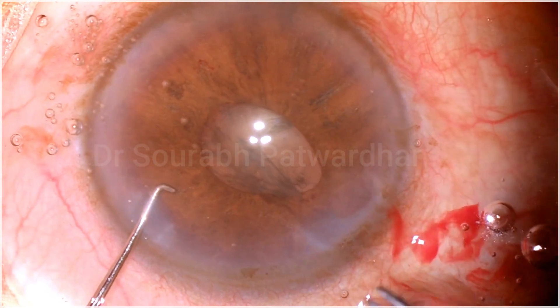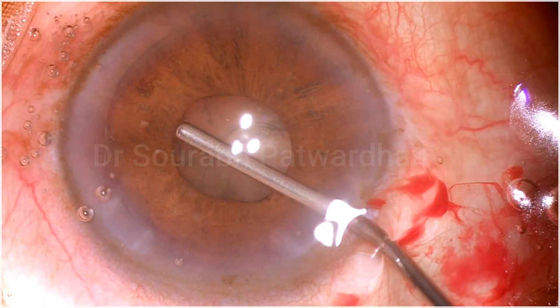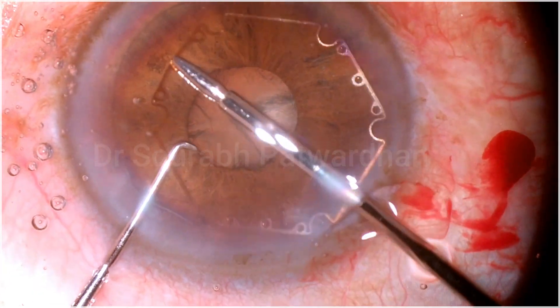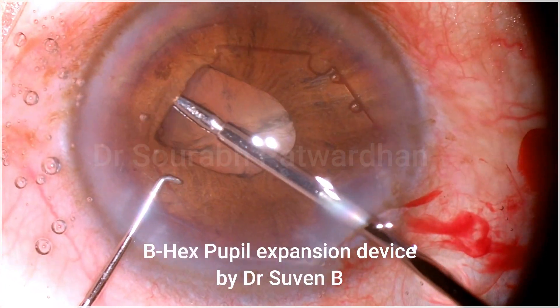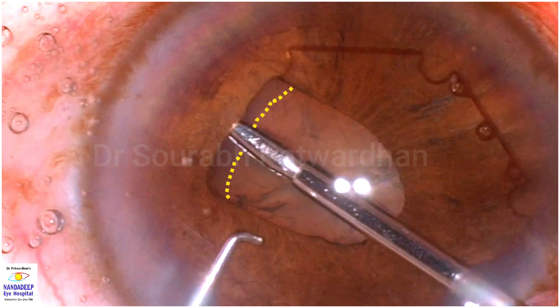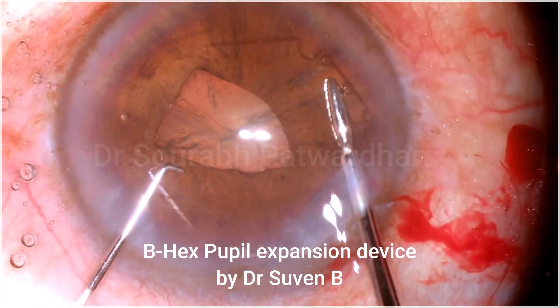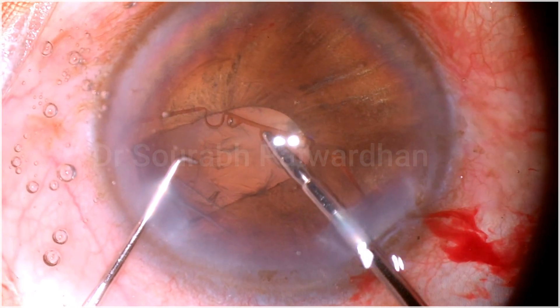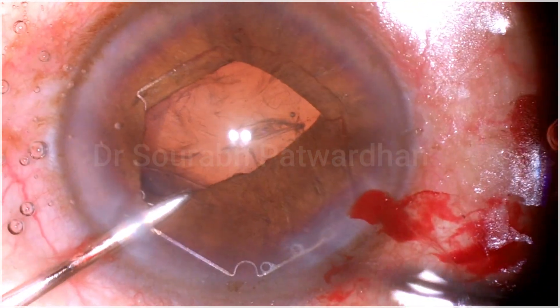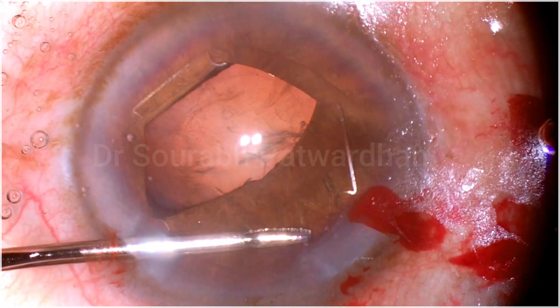I again inflated the anterior chamber with Healon and then I completed the rexis. At this point, I decided that I must use a pupil expansion device. I pushed some OVD under the iris so I can place the B-Hex ring, which has been created by Dr. Suven Bhattacharji. While putting this ring after CCC, you have to make sure that the CCC is not engaged by the device. Under visualization I put it, and if the CCC is large, you can lift the pupil device a little bit up after engaging the iris, so there is a space between the CCC margin and the device.